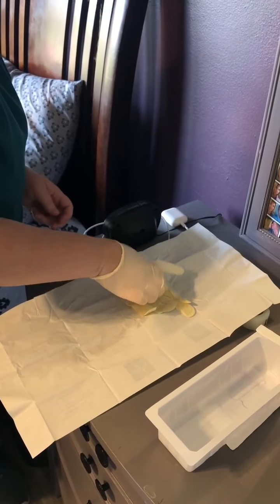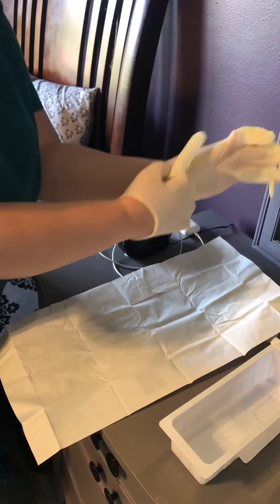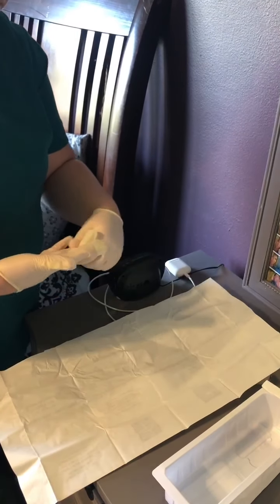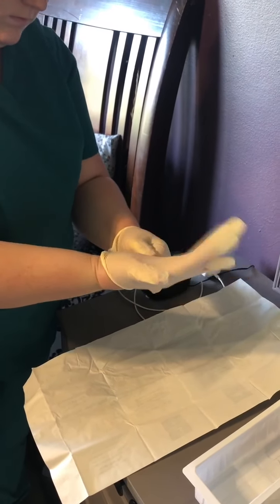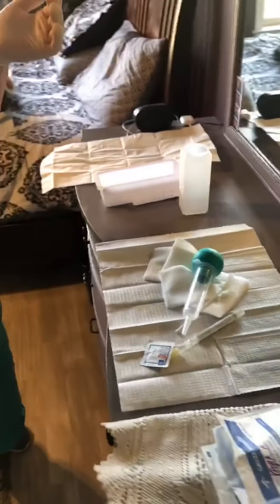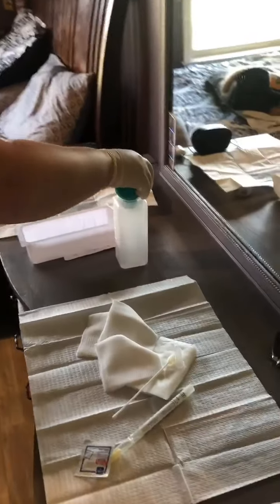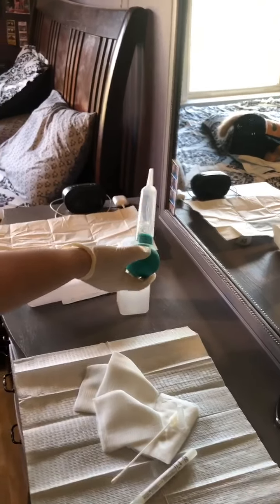So I can fix that after I get these gloves on. So now I'm sterile, and now I'm going to irrigate the wound. I'm going to take my bulb syringe. Knock over my sterile field.